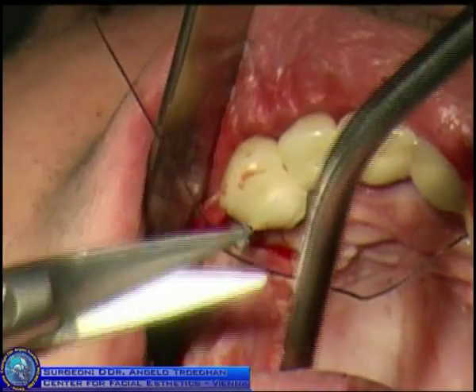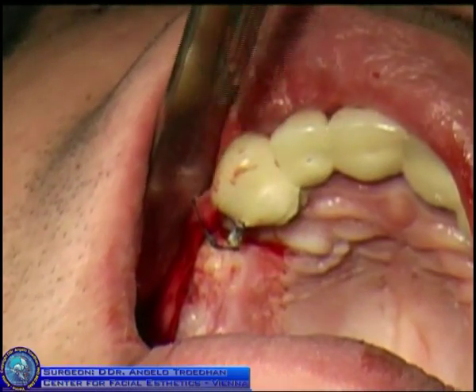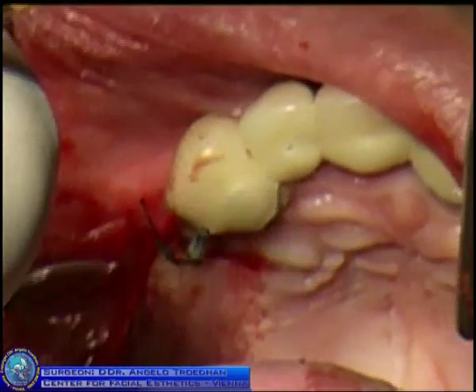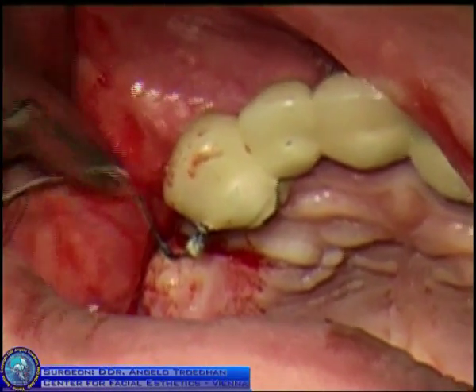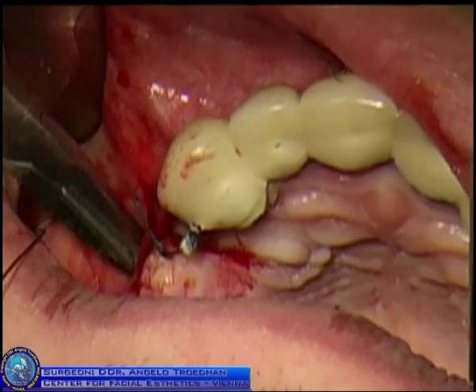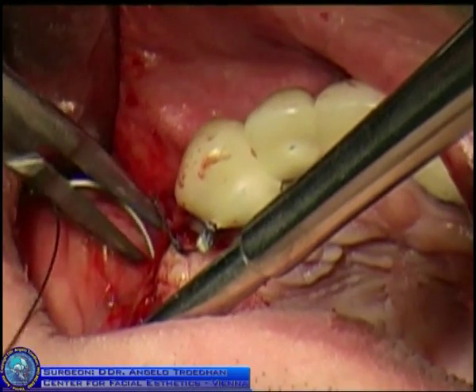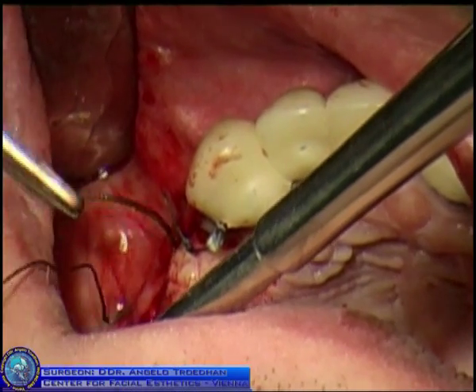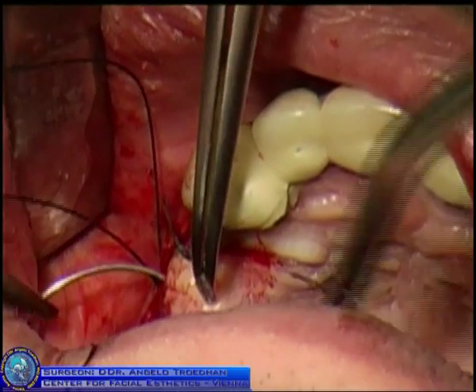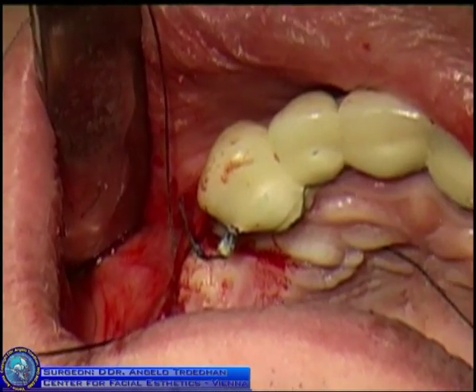How long did it take until now? One hour. Good. So, unfortunately, I can tell you now that this procedure was also a quick one. But since I promised myself to always tell the truth, it could also have lasted half an hour longer or even three-quarters of an hour longer, because sometimes you are facing problems that you cannot foresee. But the principal procedure of doing the intralift took us only half an hour.